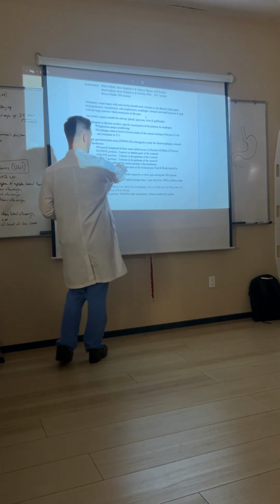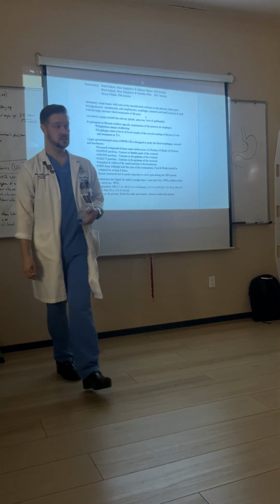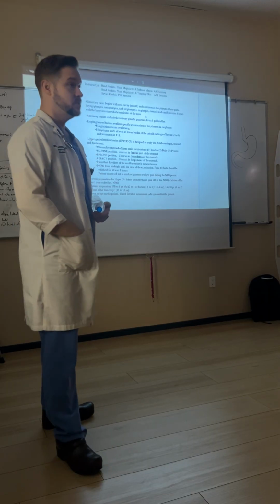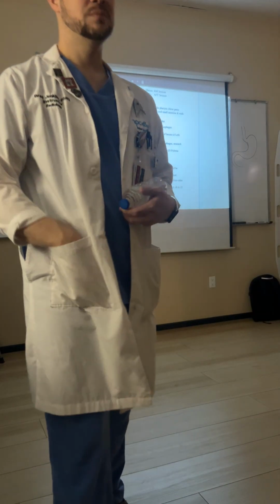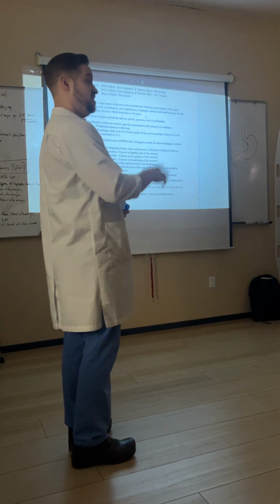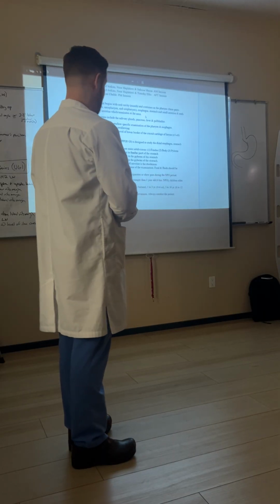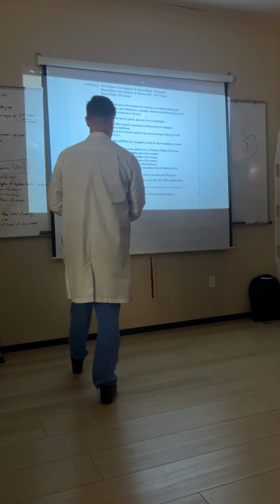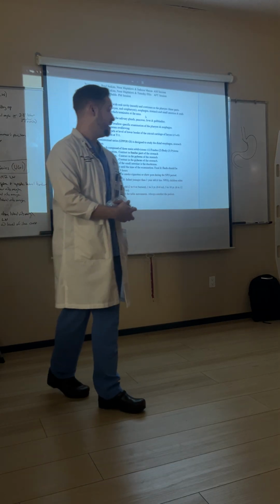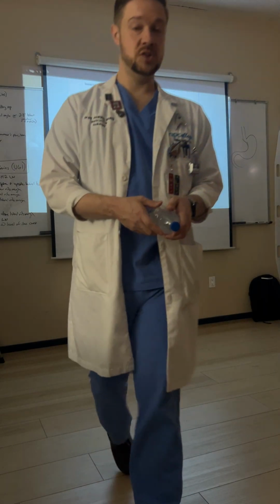The smallest and widest part of the small intestine is the duodenum. For upper GI exams, and I would say upper GI exams, not really barium swallows, the patient needs to be what's called NPO. Very differing opinions on what NPO stands for. Some people say it stands for nil per os, which means nothing by mouth. NPO from midnight until the start of the examination for adults.